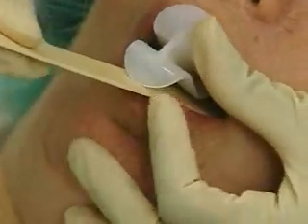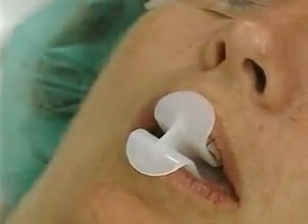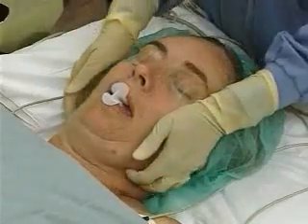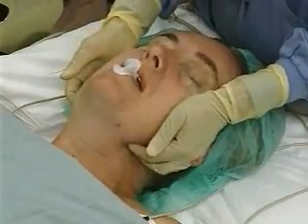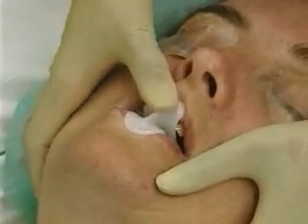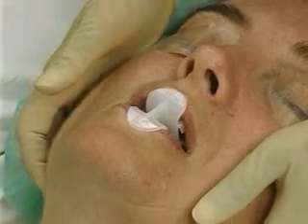The flange and one to two centimeters of the shaft of the airway should protrude above the incisors. Perform the jaw thrust maneuver to lift the tongue off the pharyngeal wall. Now tap the airway down the last two centimeters so that the curve lies beyond the base of the tongue.